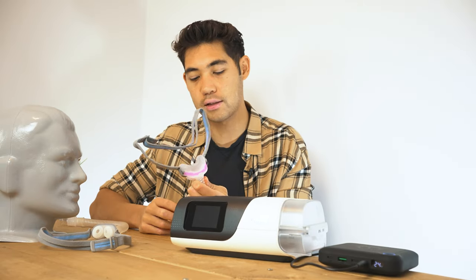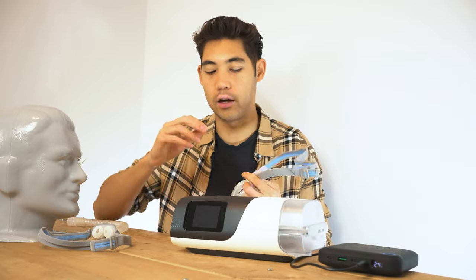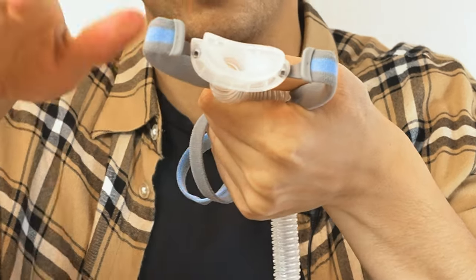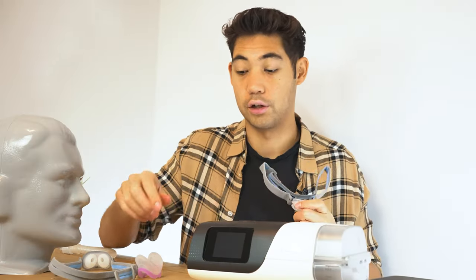In terms of the diffuser for this mask, it is extremely quiet and there's no jet of air pushing out. There are little holes on the inside that go out in different directions, so it's a very quiet mask and doesn't have any jet of air shooting your partner in the face.